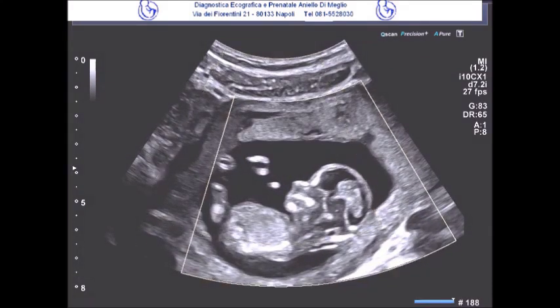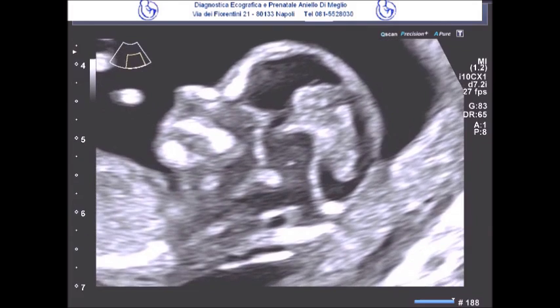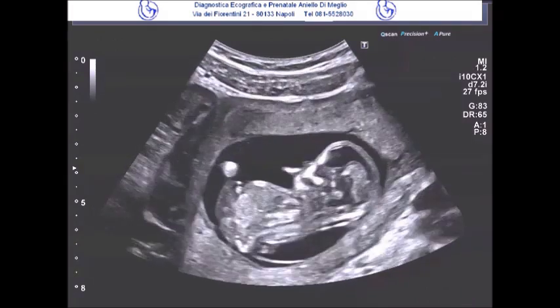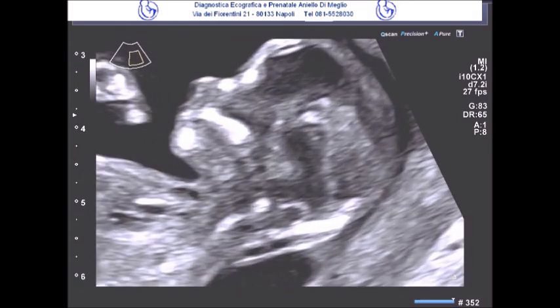When we shift to the median sagittal scan, we can clearly observe another indirect sign of this same phenomenon, which is the absence of the so-called intracranial translucency. As you can see, those three anechoic spaces that we would normally expect to see in a healthy fetus at this stage are completely absent from the view. These correspond to the brainstem, the intracranial translucency, and the cisterna magna. This is precisely a direct consequence of the leakage of cerebrospinal fluid that occurs because of the presence of an open neural tube defect.